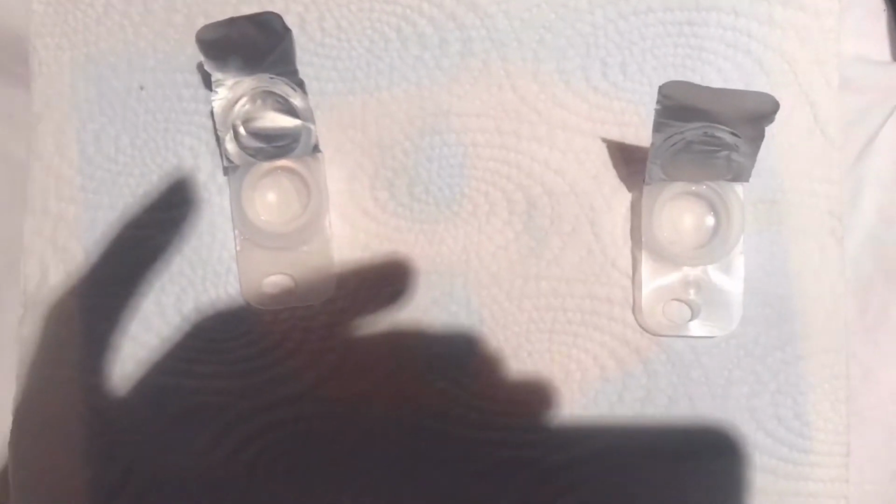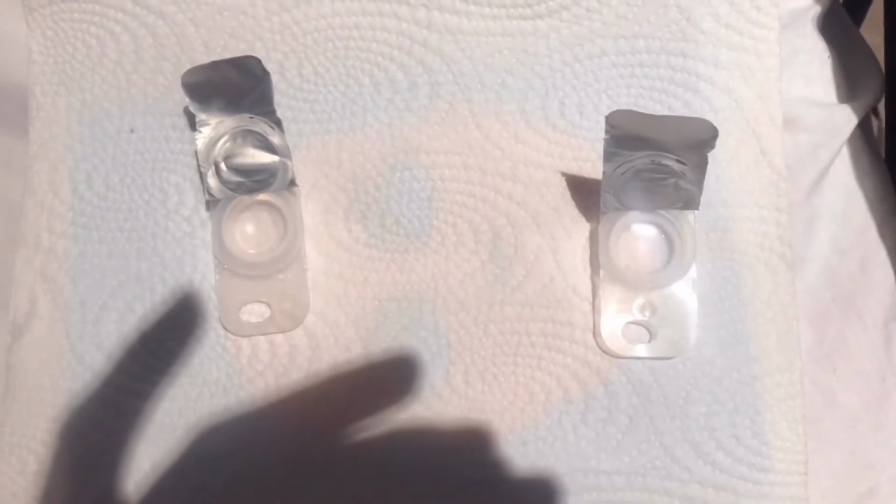This is how I do it. I put some tissue underneath. Then this is my right lens, and that's the left one. Even before I do that, I wash my hands even before I touch the packaging and everything. So there's a lot of hand washing going on.